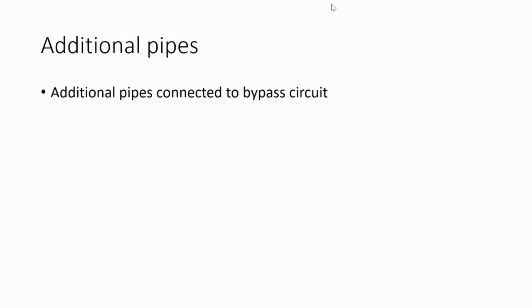And the reason that we use these once the patient's on bypass is as follows. Normally in any operation, you have a sucker, right? Now this sucker is called a rough sucker, the usual standard sucker that you use. And that will just suck stuff out that then gets thrown into the bin. When you're doing heart surgery, by necessity, by virtue of the fact you're operating on the heart, you're going to have a lot of blood accumulating in the operative field. That makes sense.